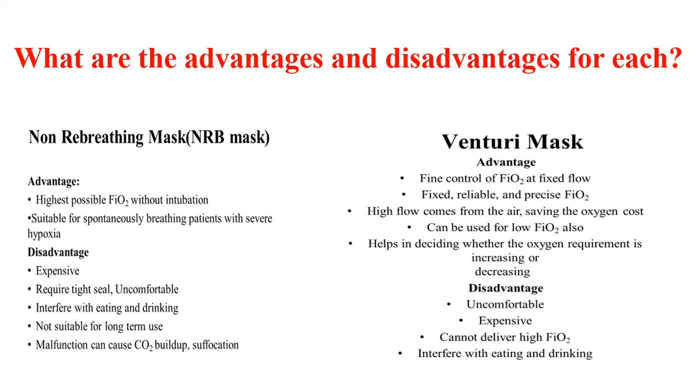It interferes with eating, drinking and talking. It is not suitable for long-term use. For the Venturi, we know that you can control the FiO2 and you can fix the flow. It can also be used with high flow, and it can help you decide which oxygen level you want.